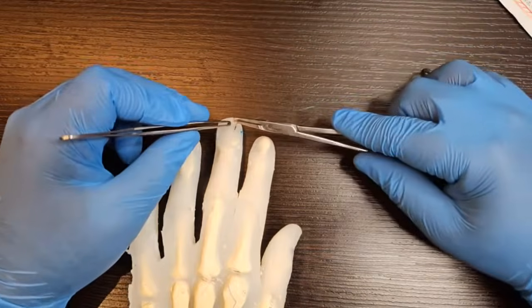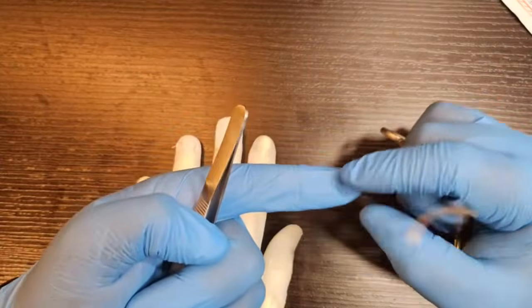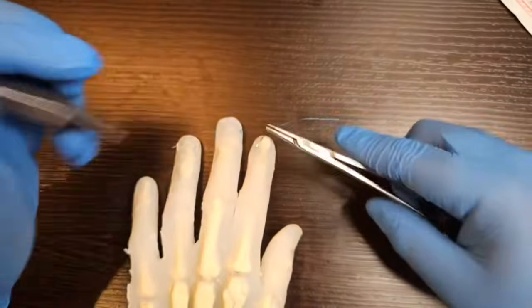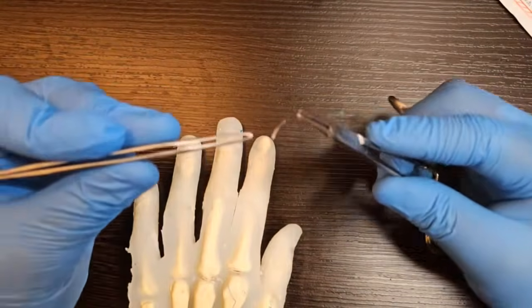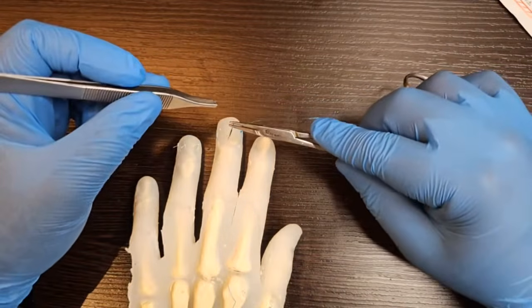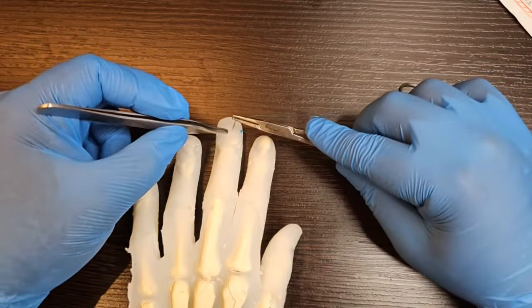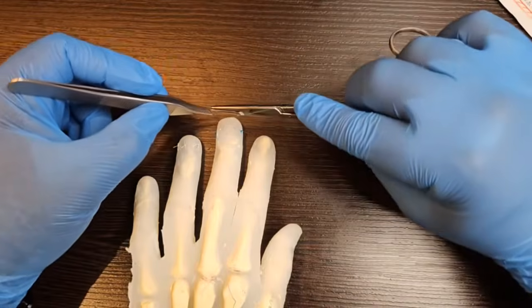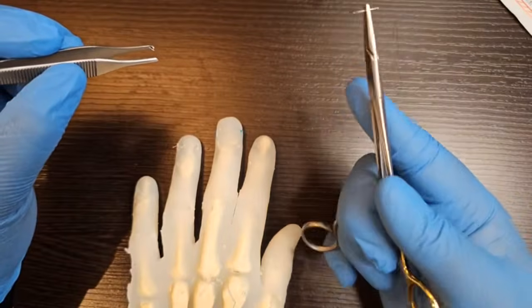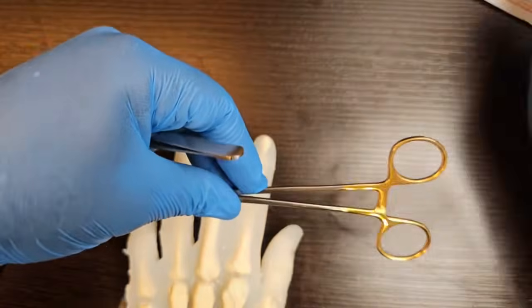Now, the key with this is that the nailbed itself is very thin. So on pulp skin, there's a lot of subcutaneous fat to get through to tendon, to bone in the way. On the nailbed, as soon as you go a millimeter in with the needle, you might have hit the bone. So using a small suture on a friable, thin substance, I will often take my fingers out of the needle holder, like so, to give myself more range of movement. I'll put the scissor down so that you can really see this technique.